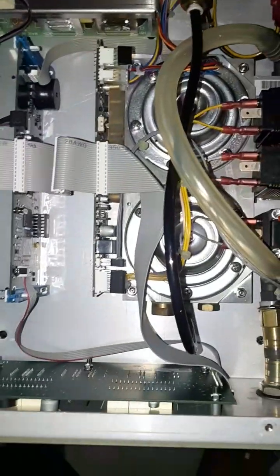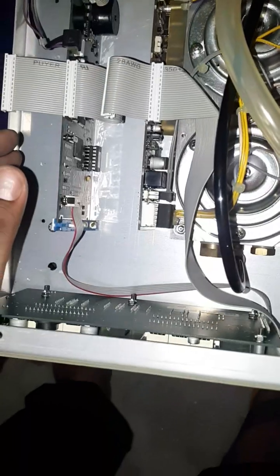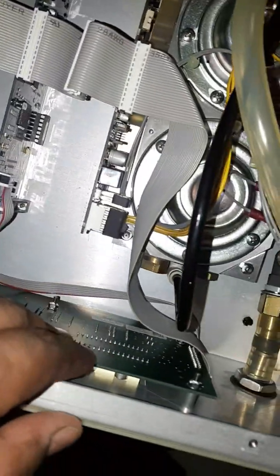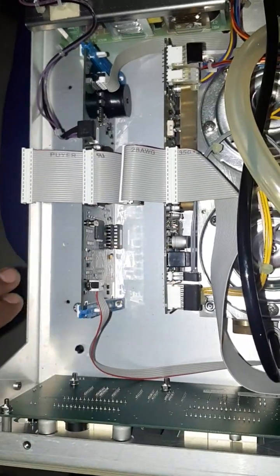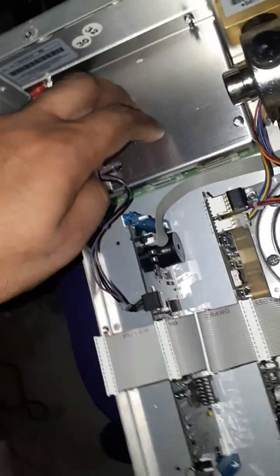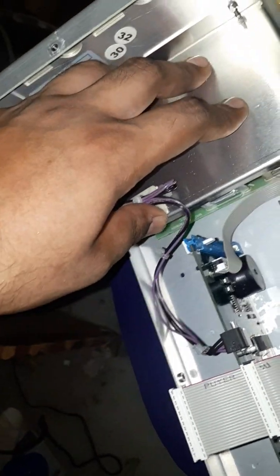And after that you can see, after opening this insuflator or any insuflator, you will get the same kind of inside boards. This is the front display board you can see here, and there is this ribbon cable which is controlling the 7 segment, and there is the control board. There are 2 control cards. One is the pressure control card, another is the display and the microcontroller and the alarm signal control card. There is the power supply here, and you can check the power supply also, if input is coming or output is going or not.